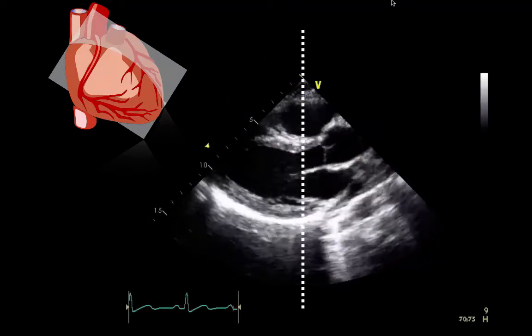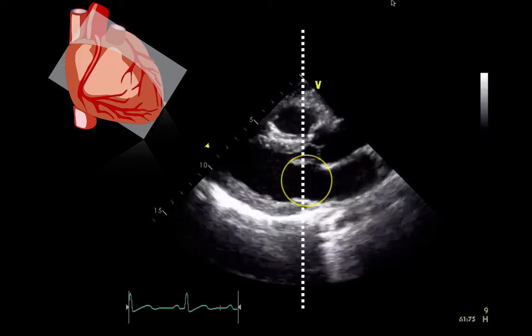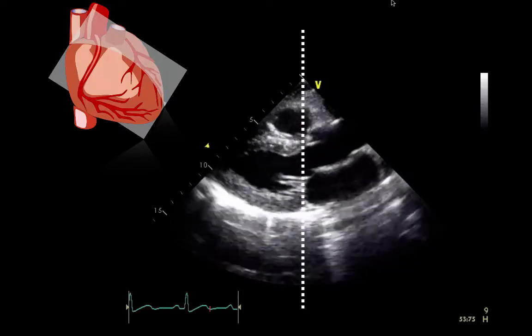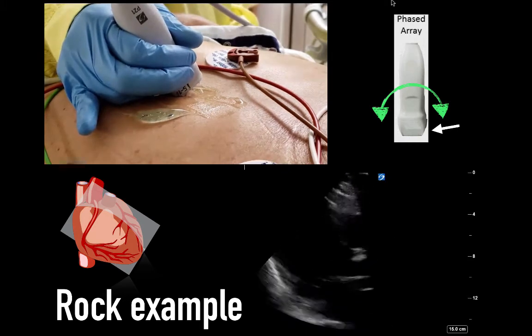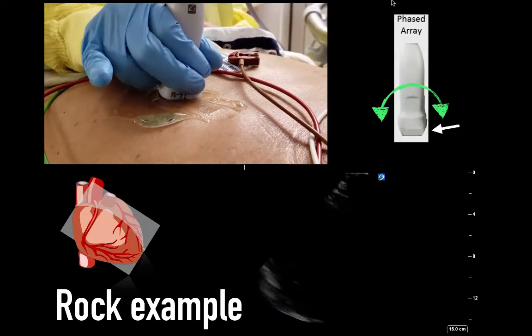This is the ideal view, obviously quite challenging to obtain, but you want to have the mitral valve fall roughly in the middle of the screen. You're interested in the base and mid portion of the LV and not so much in the LV apex at the parasternal long axis. And so this would be the ideal angle to obtain this view. Again, this is the rocking example which displays how this long axis view is obtained to ensure it's on axis.